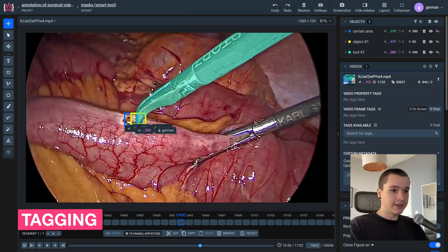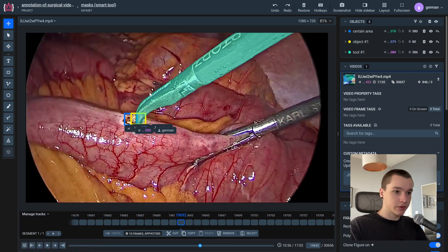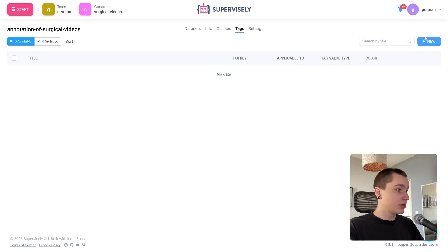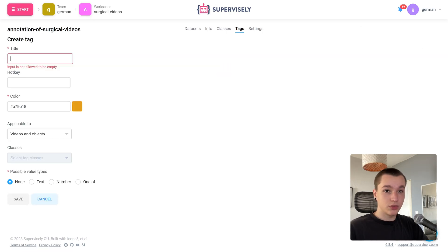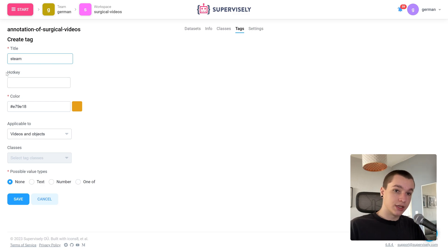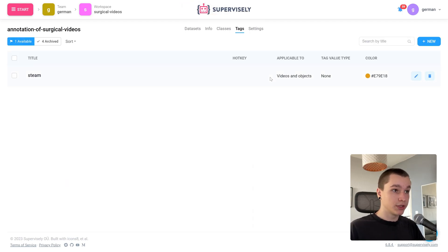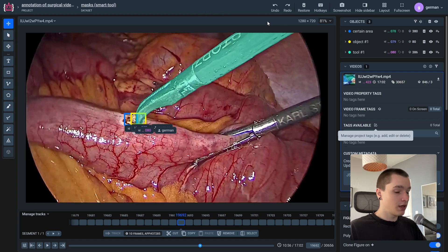The last thing I want to show today is video tagging. To tag a video, we need to create a tag first. As you can see in this section, we currently have no tags, so we need to press the Edit button and then click Create New Tag. Let's set the tag name — I'll call mine 'steam'. We can set a hotkey or a specific color if needed. The most important thing is to set the value type. For this specific video I need a none-type tag. Let's click Save.